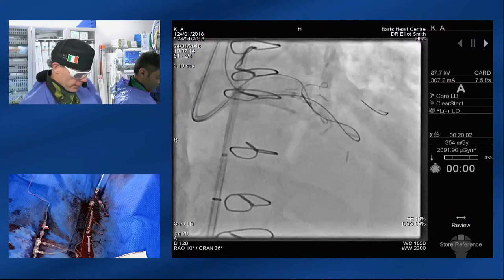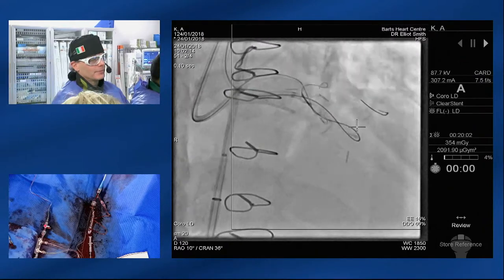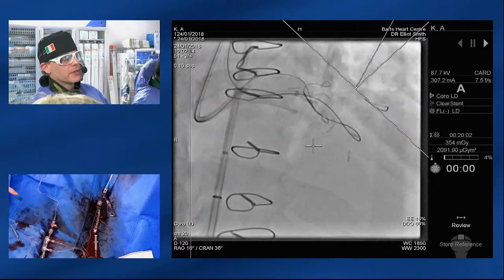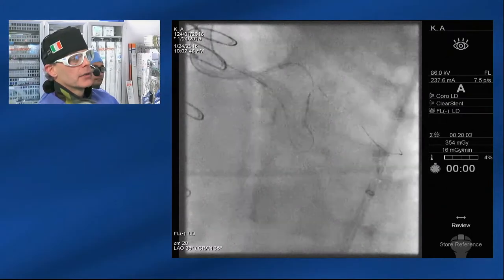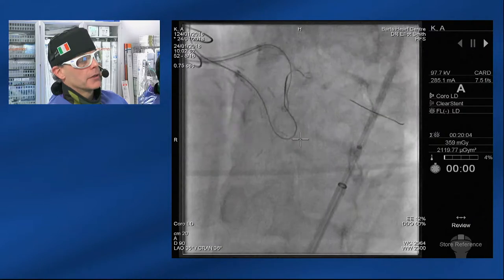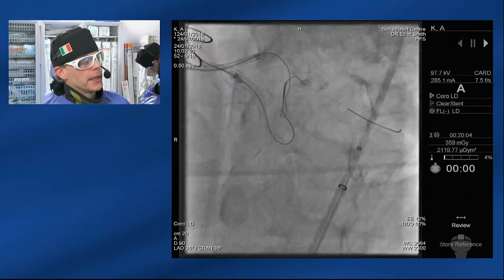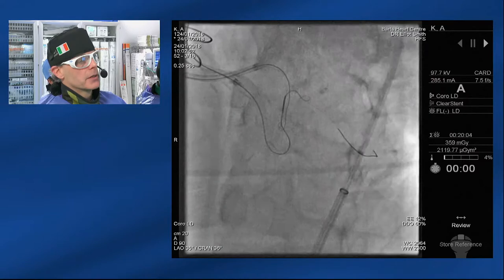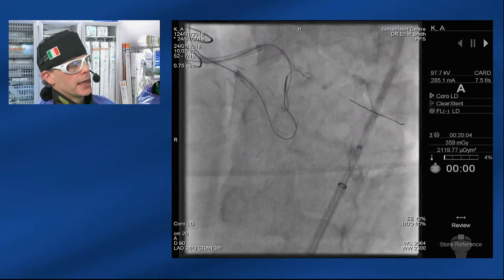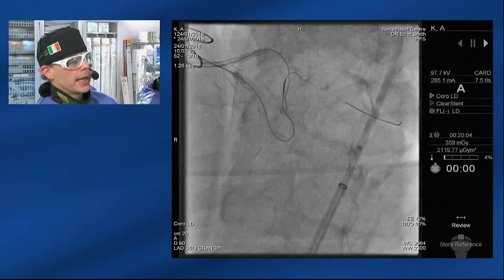Coming from 11 o'clock you've got the vein graft, wire down the vein graft, and the LP around the corner and back up. You've got a knuckle extending from the LP into the diagonal branch in the sub-intima as confirmed by IVUS. You have an antegrade wire coming down through the cap with a very small knuckle at the LAD anastomosis. We need to be very careful that the knuckle doesn't extend into the LAD and cause vessel compromise. It's a small segment — there is calcium, there is angulation.